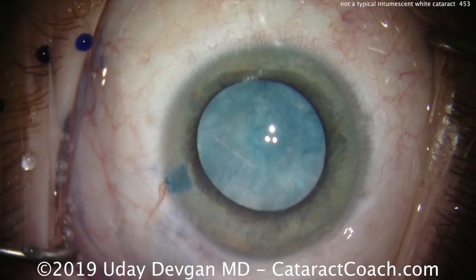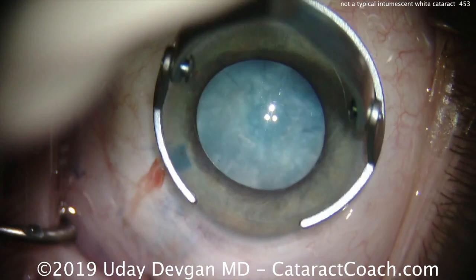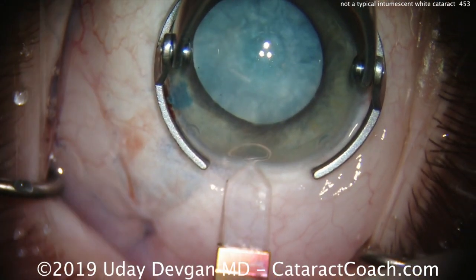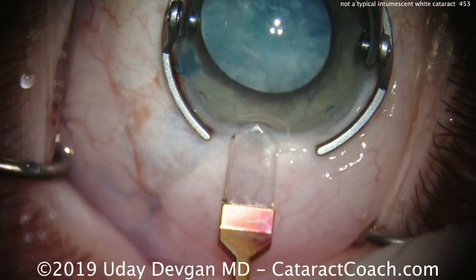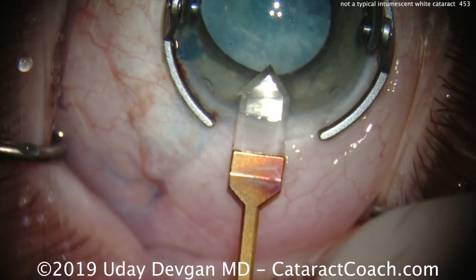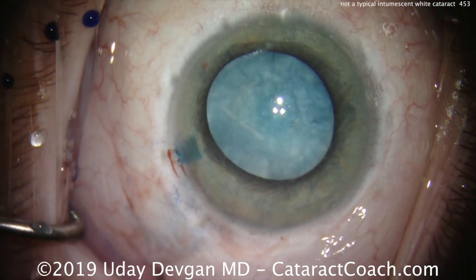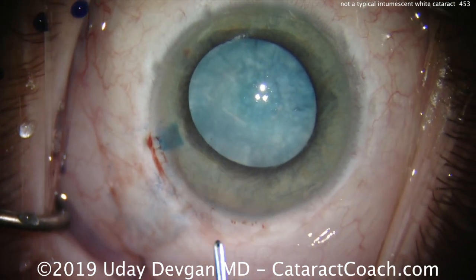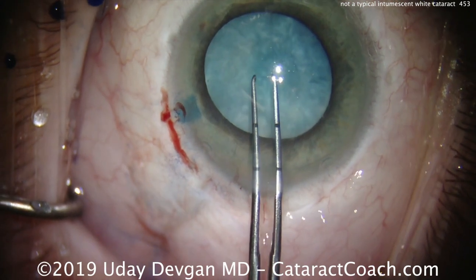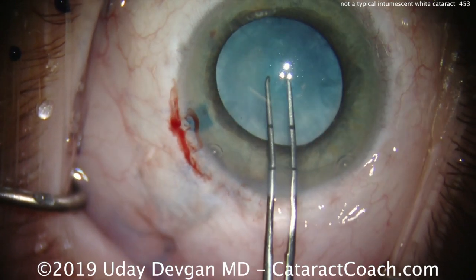Now the key in this case, of course, is the rexis. And when we do this, we'll make our incision. Interestingly, I like to sit temporally for most of my cases. I know a lot of the other surgeons are sitting superiorly, but in the US, temporal is more common. I like it because it's further away from the visual axis, and I think it gives me better access to the anterior chamber. And also, that's where most of these elderly patients have their astigmatism.